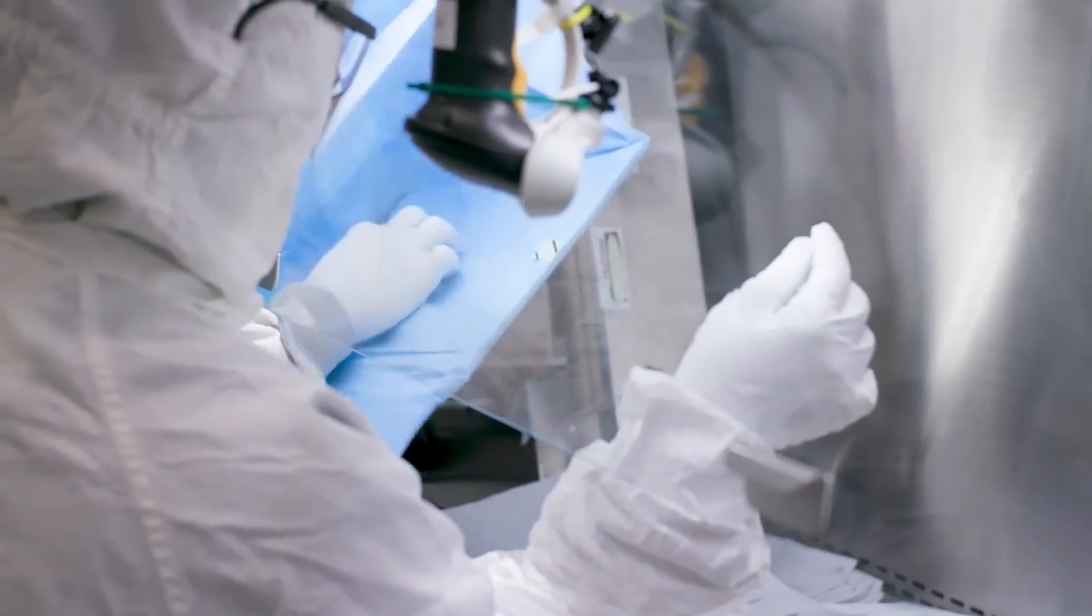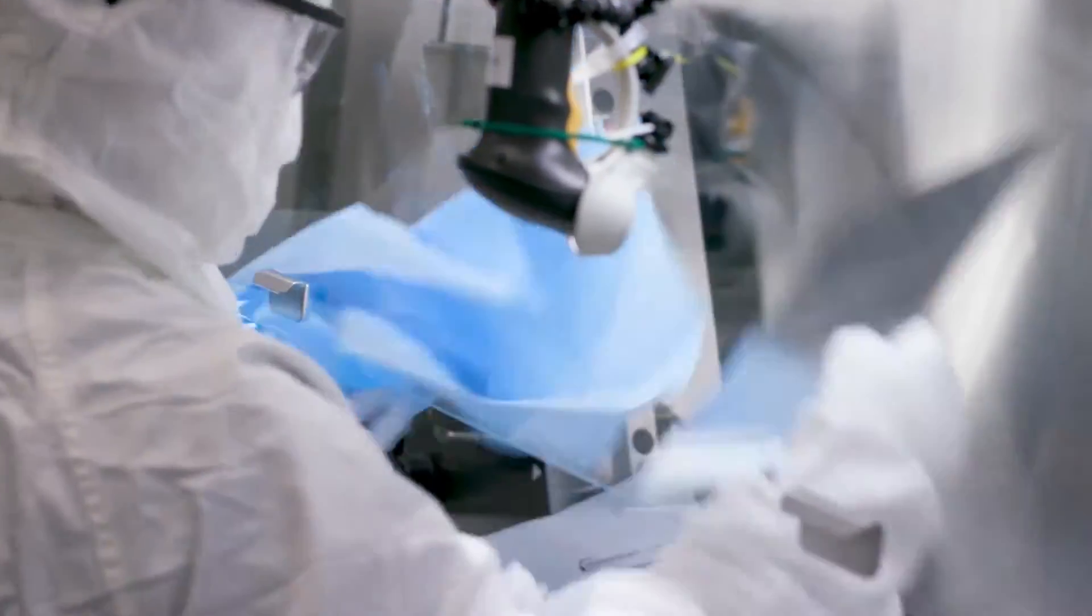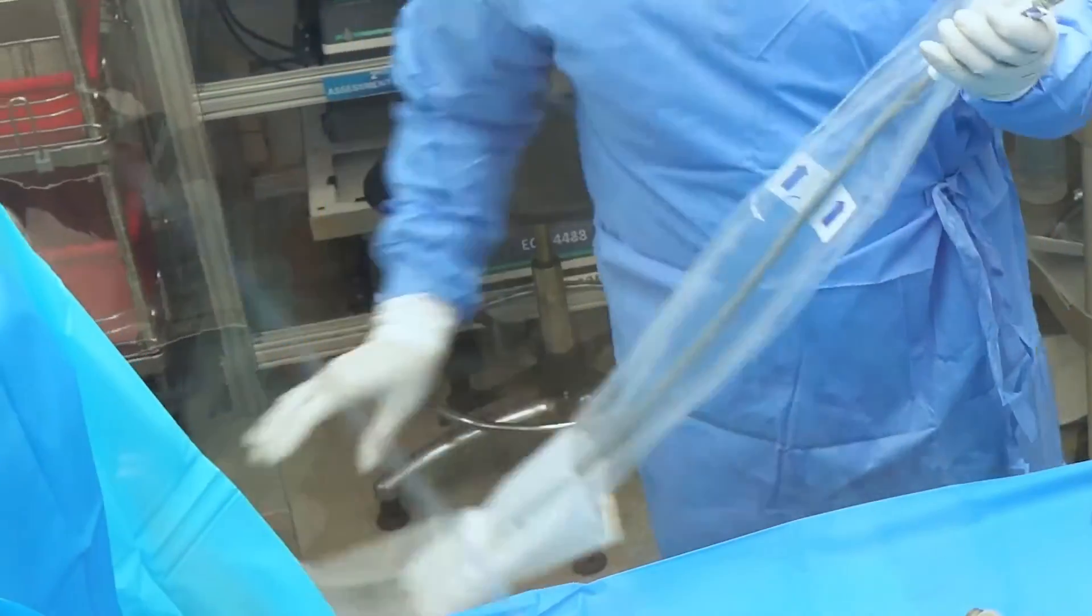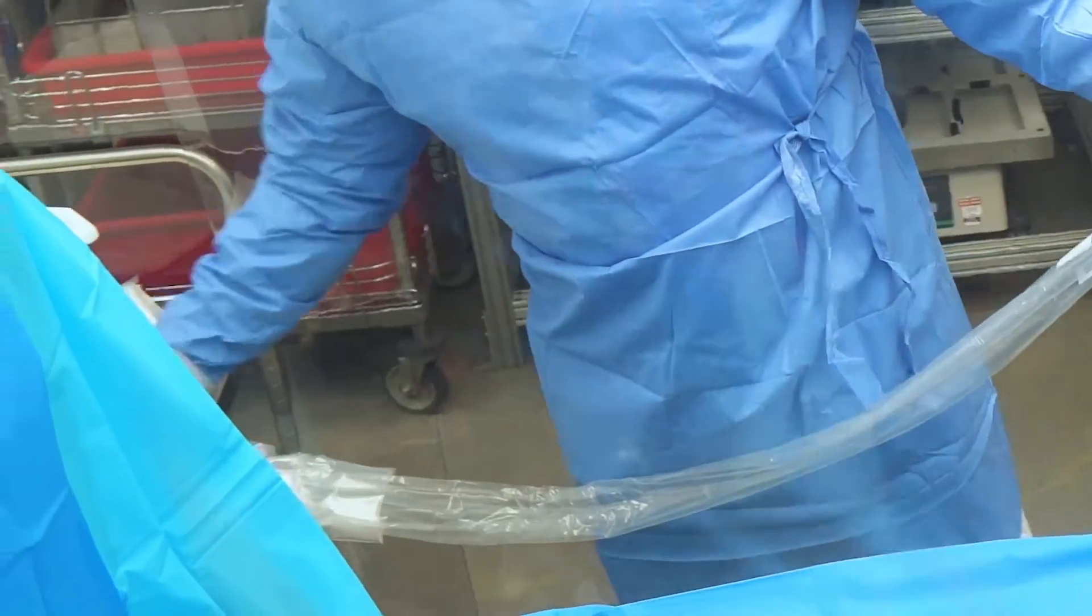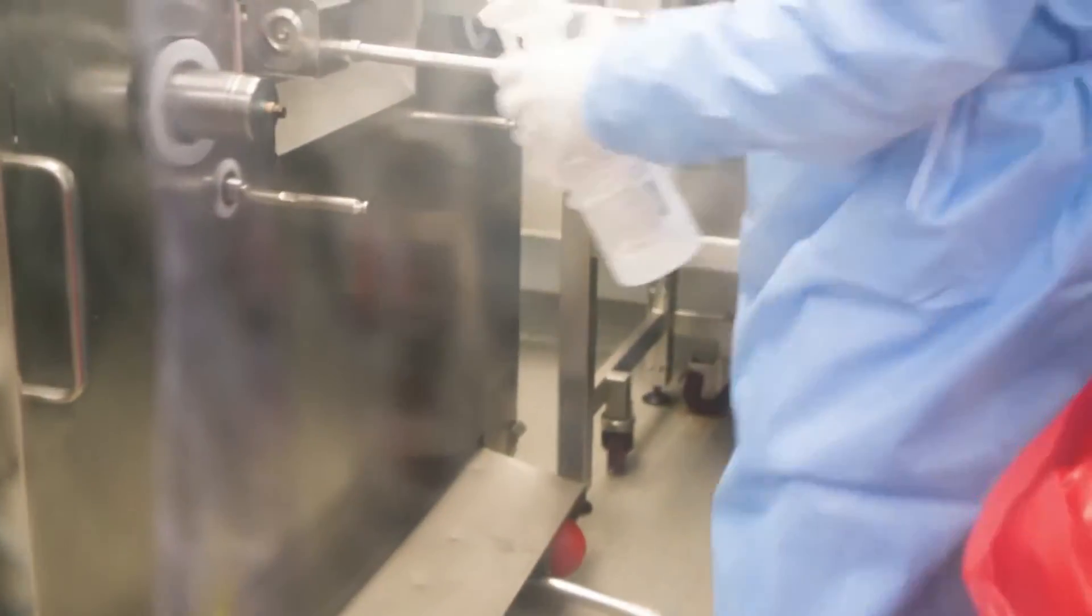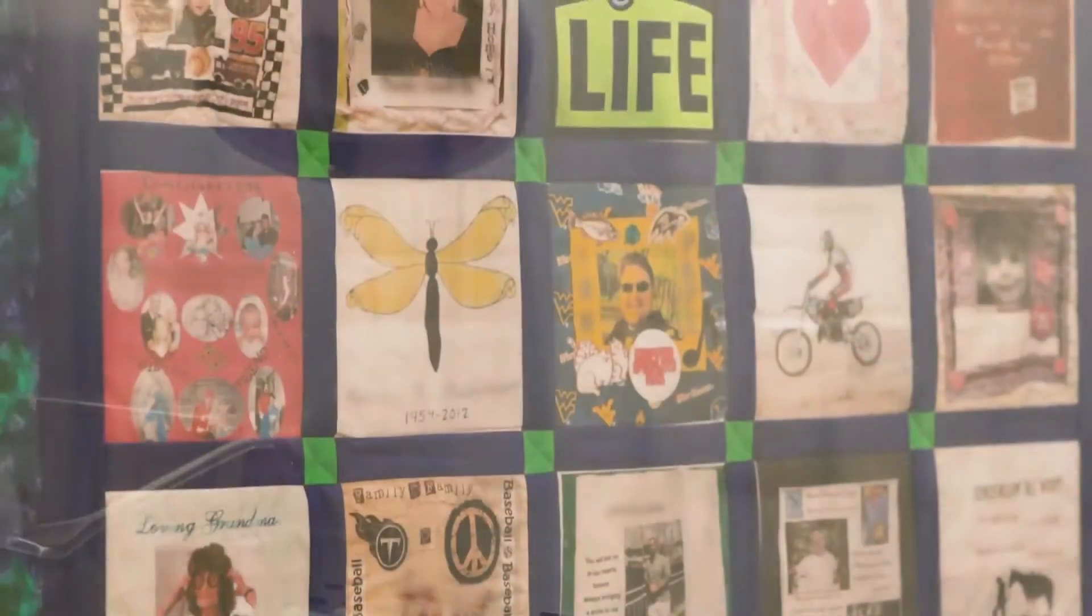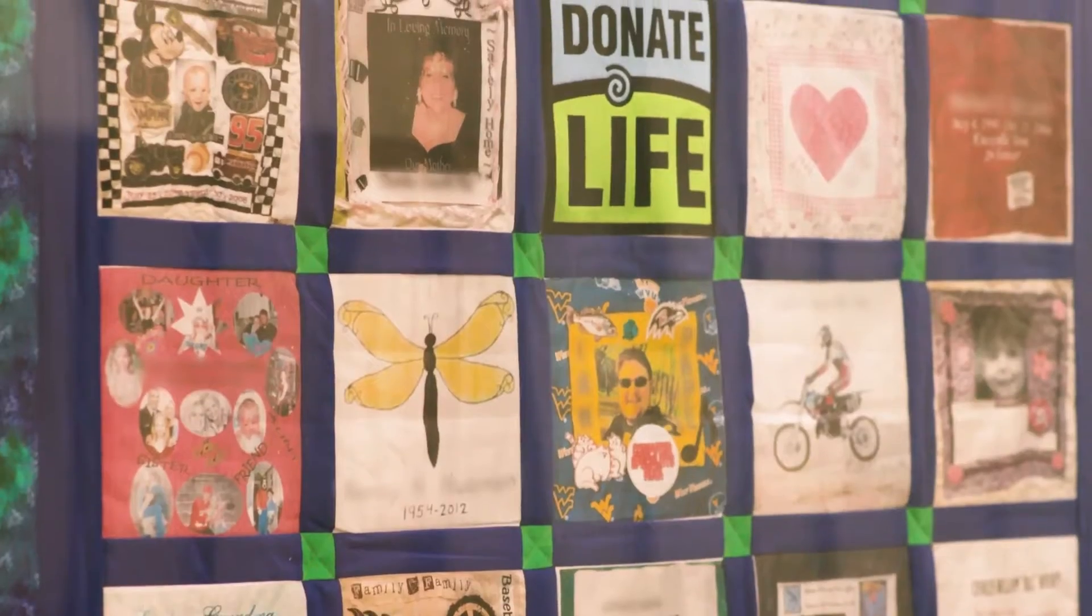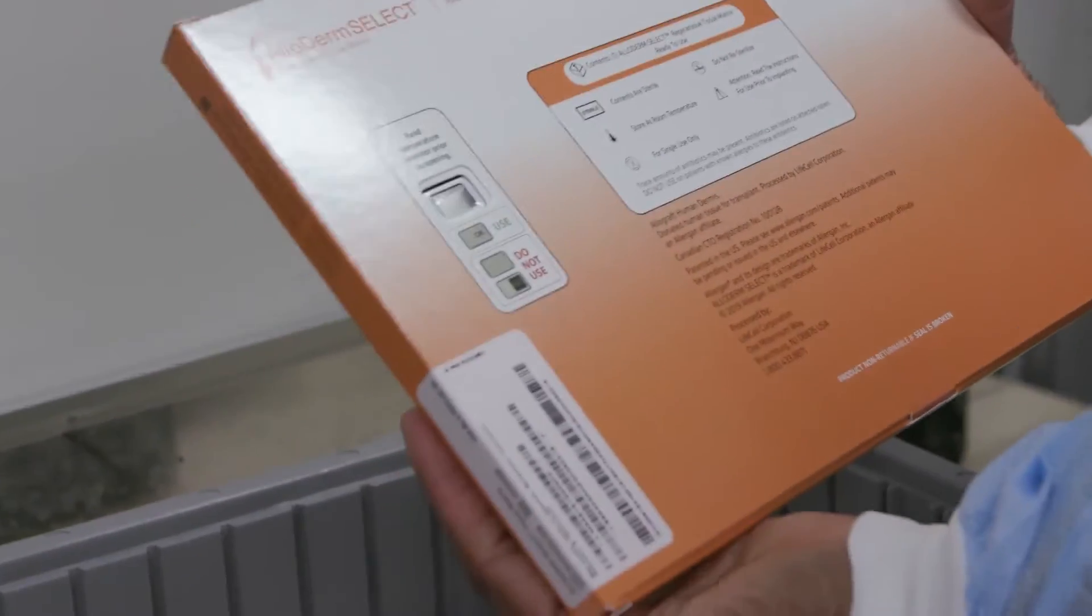We take extra steps to ensure a separate toolkit for each donor, autoclaved between each step. This ensures no cross-contamination of our products, so we have full traceability through our process from donor to patient when it's implanted.